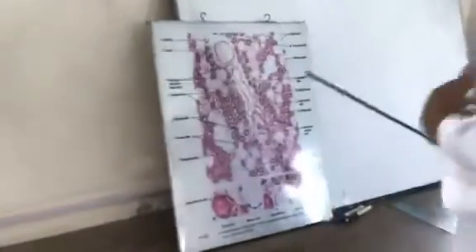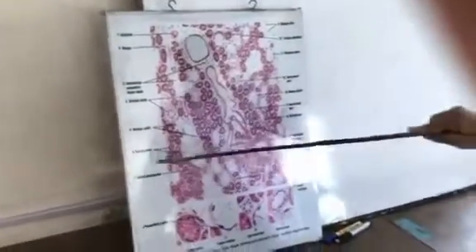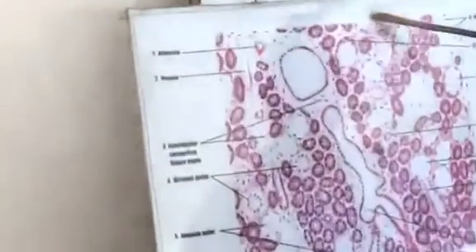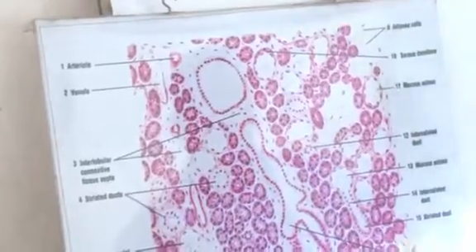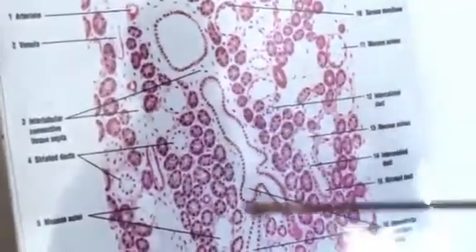Now I will show you the structure of submandibular gland. Look here, this is the structure of submandibular gland, and here the capsule is actually absent in this figure. The capsule lies outside the whole structure and covers the whole gland. From the capsule, these light zones are the interlobular septa.